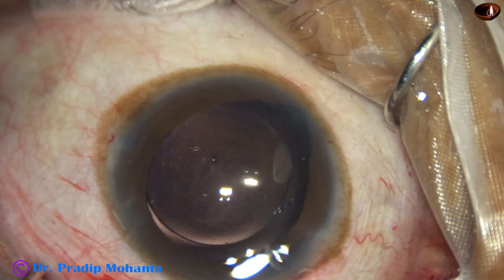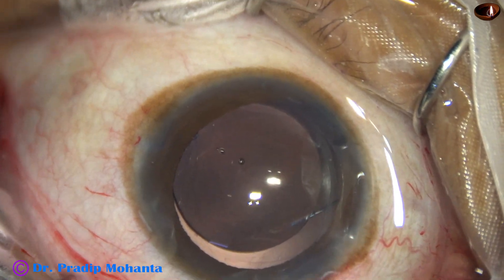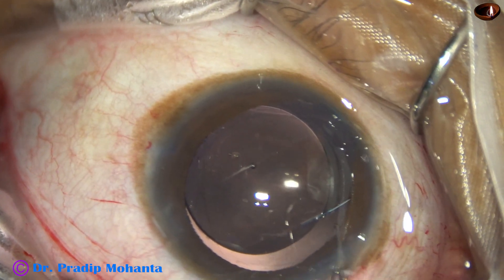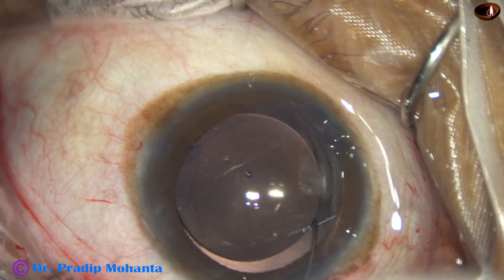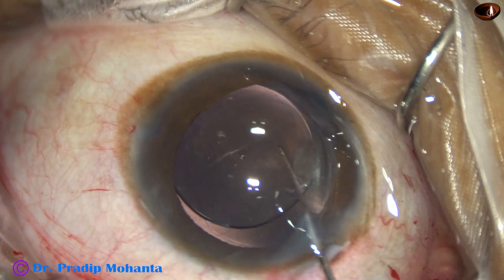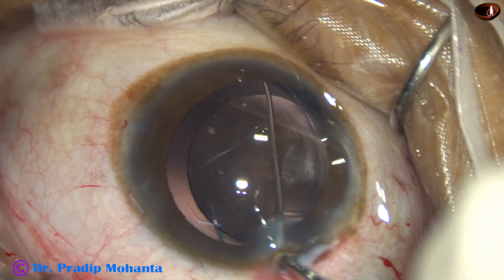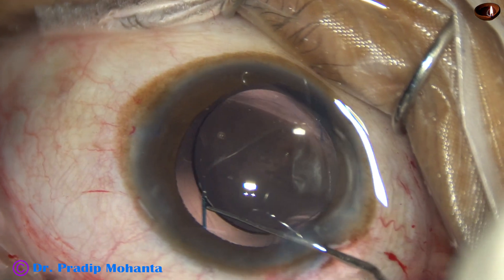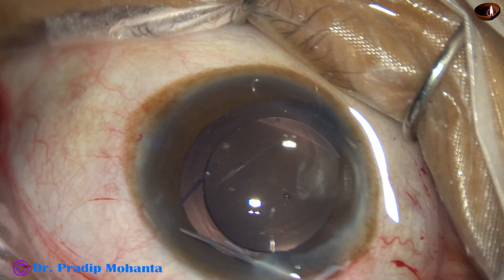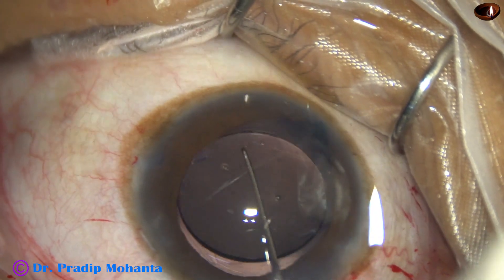The ocular surface is thoroughly irrigated because a lot of visco was there and it causes some hindrance in visibility. My plan is to rotate the haptics and be sure that they are in the sulcus. This haptic is brought out over the iris and again it is placed in the sulcus.